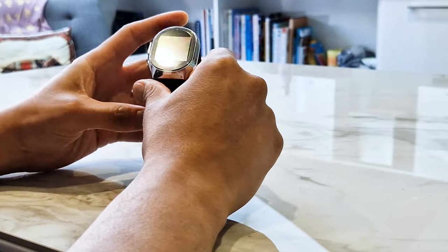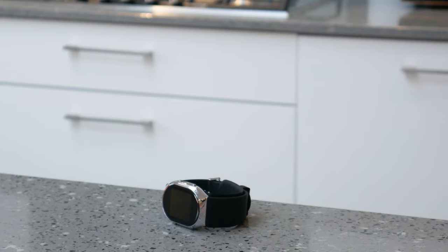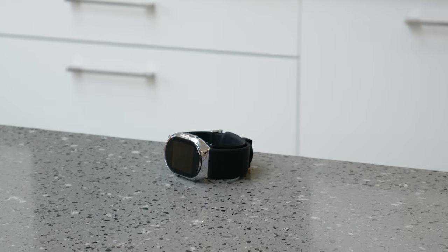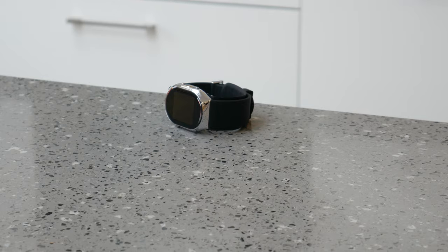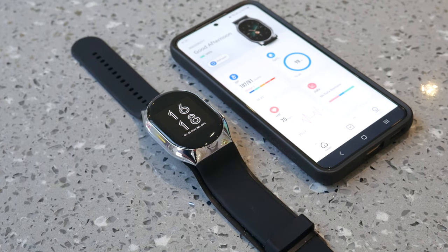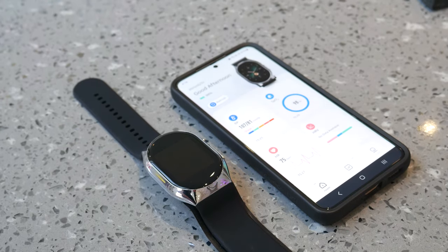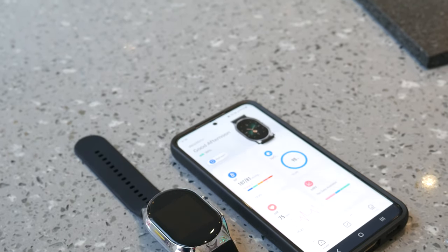The watch itself comes in a bit of an oval shape with a chrome surround, black on silver design, and a silicone strap — quite a nice looking piece of kit. You need to get the phone app called BP Doctor Plus from the App Store, download it, then sync the Bluetooth to the watch through the app. It's quite a straightforward process — no issues first time.